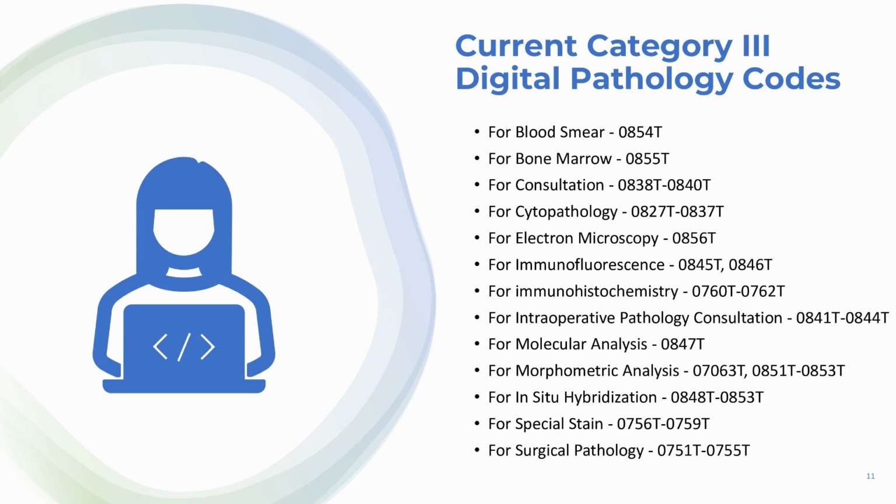And these are relatively new codes. In 2023, the AMA released new digital pathology CPT codes developed by CAP. These codes are designed to report the additional clinical staff work and service requirements associated with digitizing glass microscope slides for primary diagnosis. So in 2023, 13 add-on codes were introduced, and in 2024, 30 new add-on codes were released. The future outlook: it doesn't seem that there are any new Category 3 codes specifically announced for digital pathology.